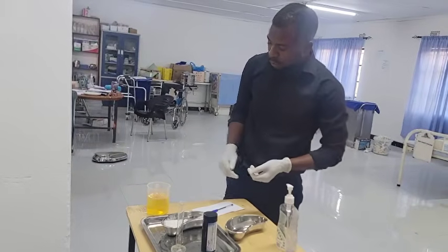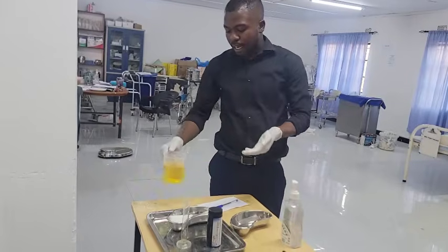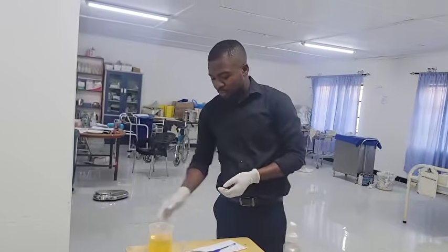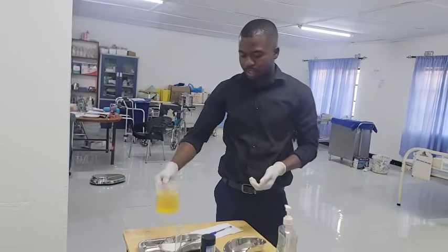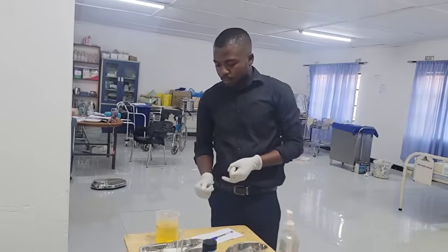The second physical property is the color of urine. For the color, it's supposed to be straw amber or clear amber. So you're going to tell the examiner, my examiner, the color of the urine is straw amber or clear amber. That's the second property under the physical properties.